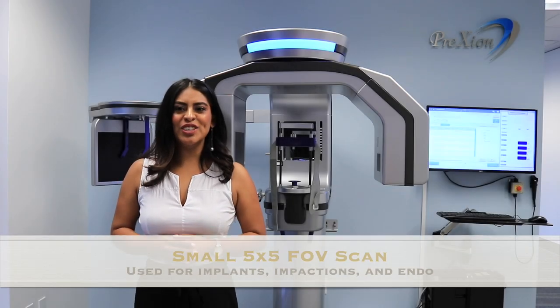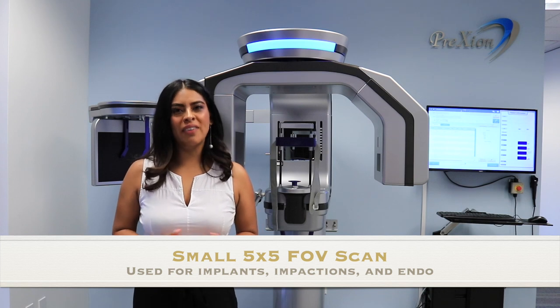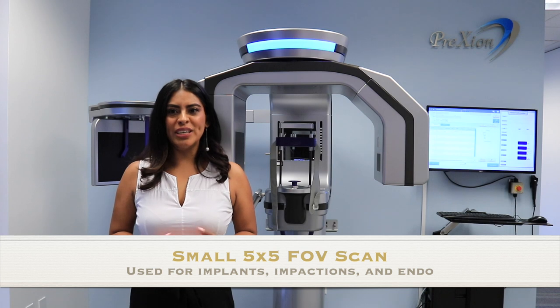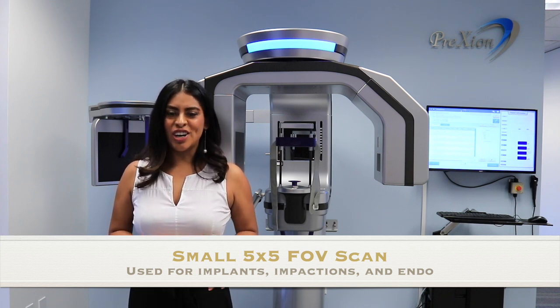In this video, I will show you how to capture a small 5x5 field of view scan. This size scan is commonly used to capture 2 to 3 teeth for a single implant site, to check for an impacted tooth, and also used for endo.